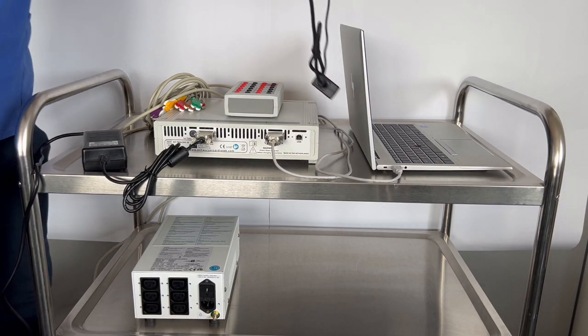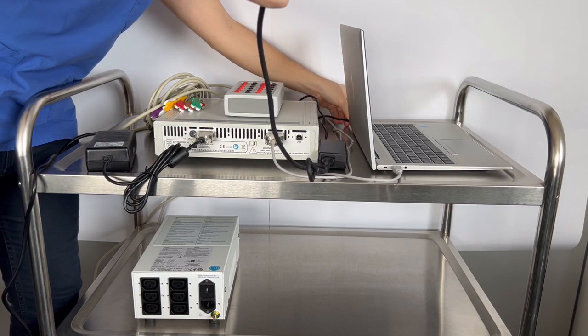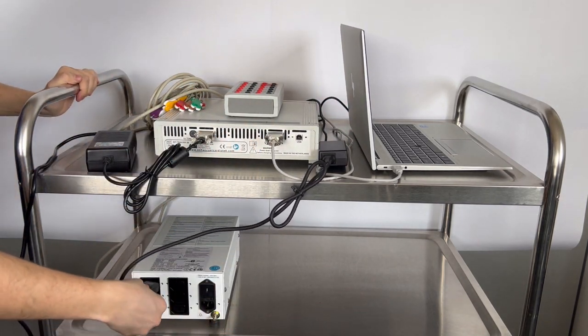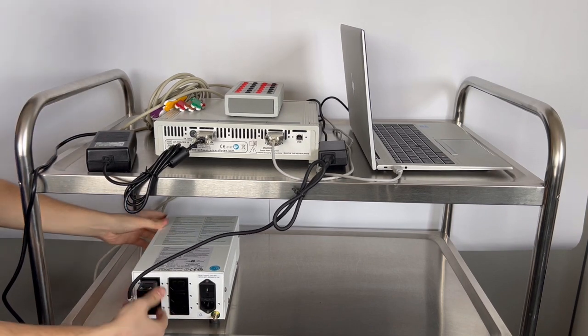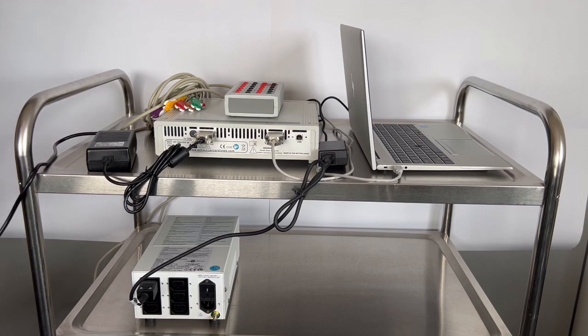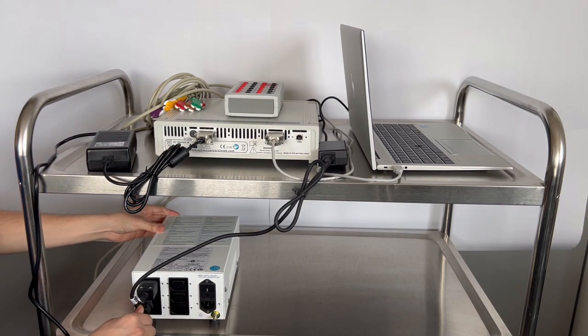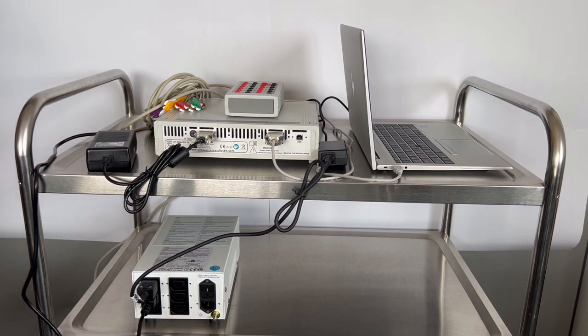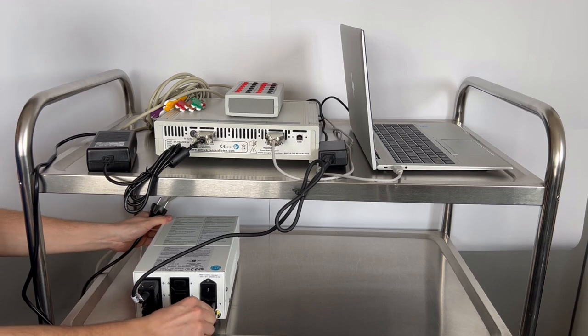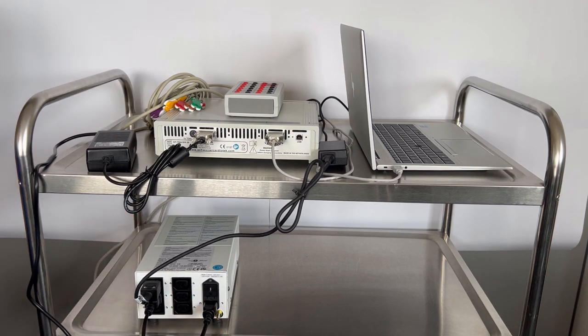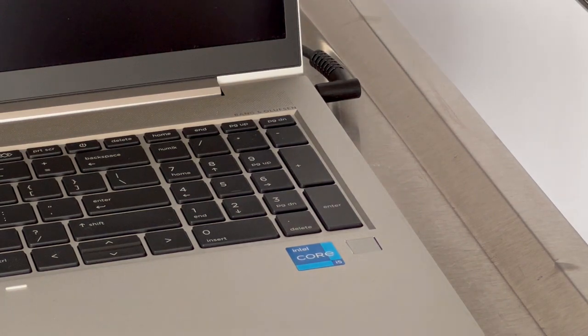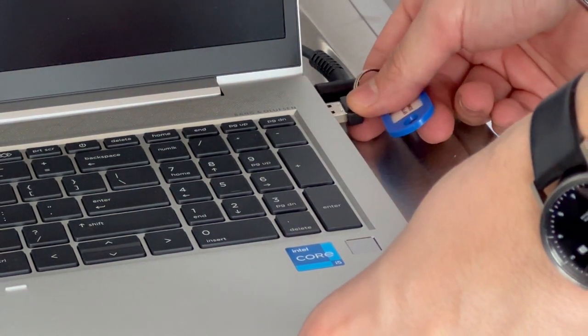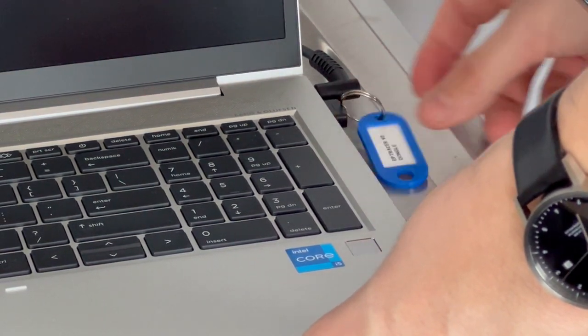Connect the power cables from laptop and amplifier to the back side of the transformer. Finally connect the mains cable from the transformer to the power socket. Additionally, make sure the supplied USB dongle is connected at all times.